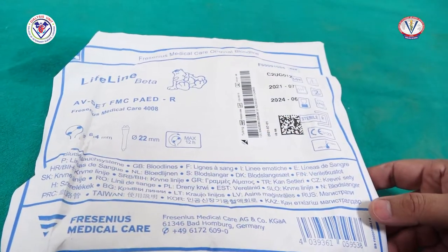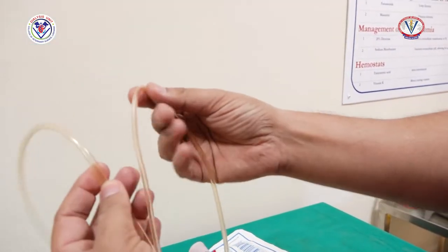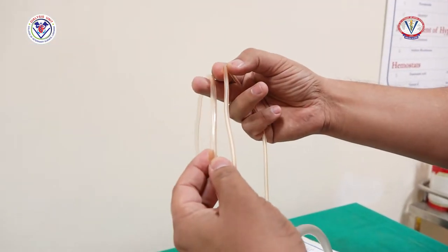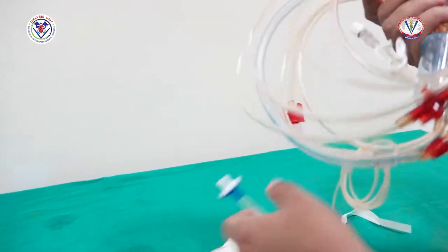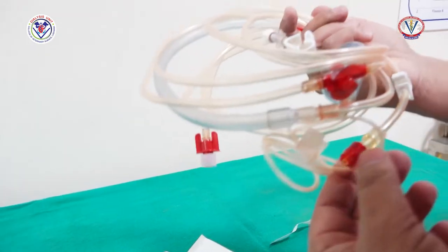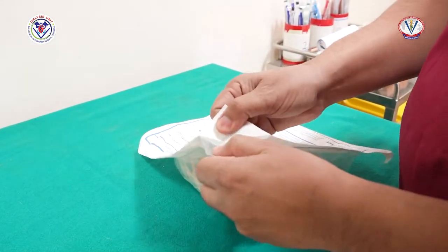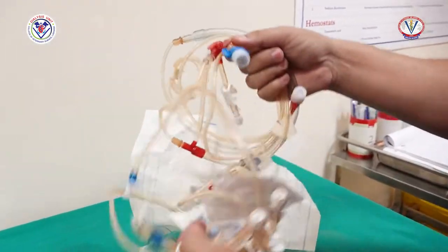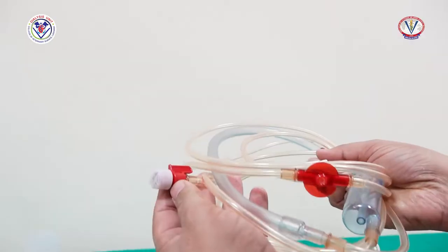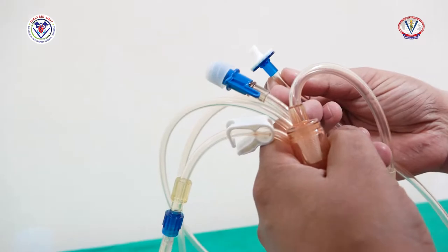Another important component of dialysis is blood tubing. This tubing comes in different sizes, and selection is done on the basis of the patient's size and blood levels, as anemia is a common finding in patients suffering from renal failure. When we open this package, we get two sets of tubes, one which has red ports and the other which has blue ports. Red signifies the arterial line, whereas blue signifies the venous line.